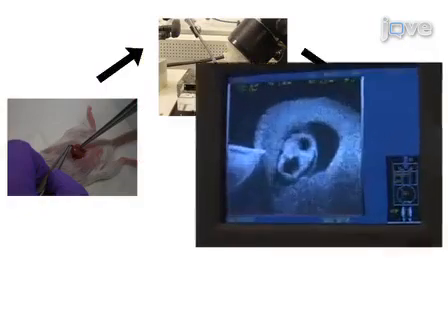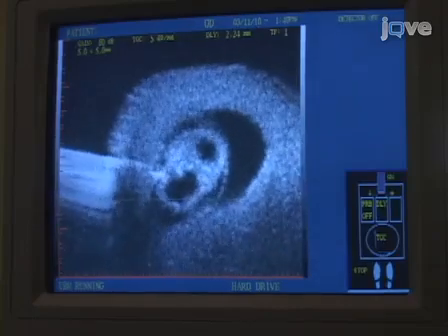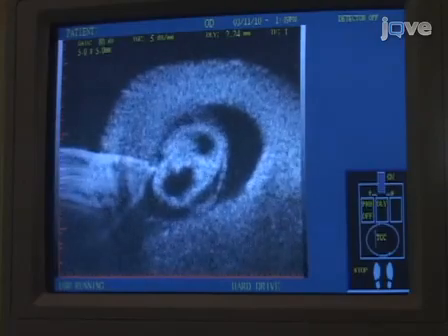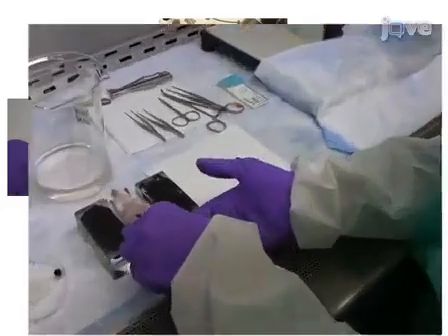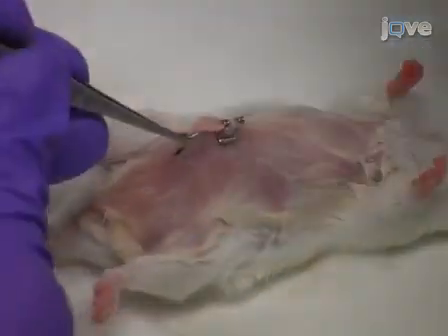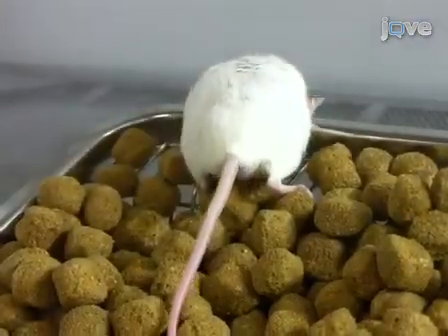The third step of the procedure is to use the real-time ultrasound image to direct the microinjection needle to the injection target site. Embryos are injected in series until the desired number is completed. The final step of the procedure is to remove the mouse from the injection apparatus and close up the incisions in the body wall muscle and skin. The animal is then allowed to recover.